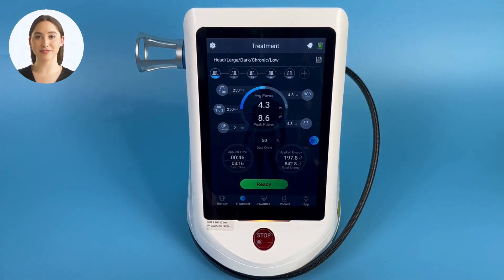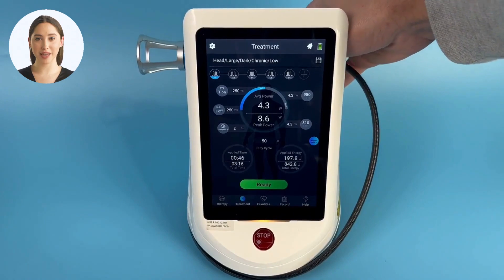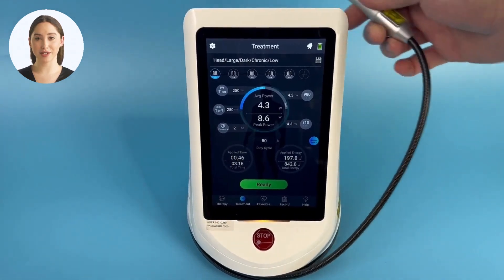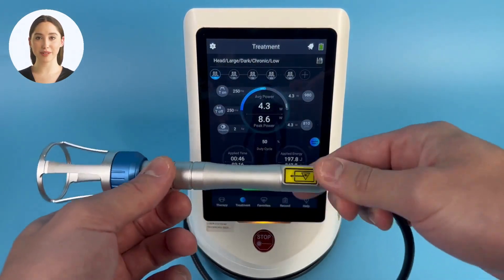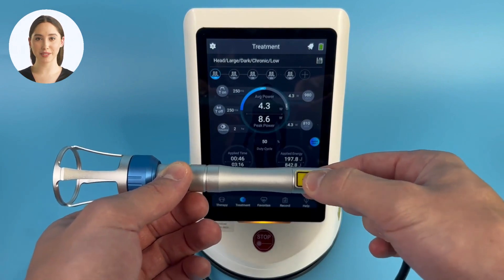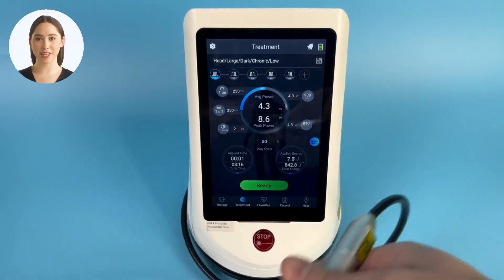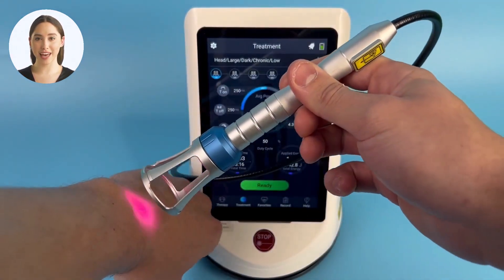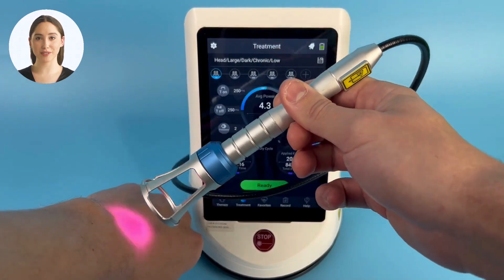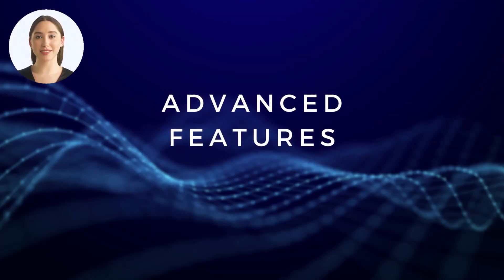Now we are on the final screen before treatment. Here you can see the treatment parameters we have selected. Now select standby and the laser is armed for treatment. Remember, safety glasses are always required. Push the button on the emitter head of the laser and treatment will begin. Move the head of the emitter around to avoid overheating and ensure you are following best practices.